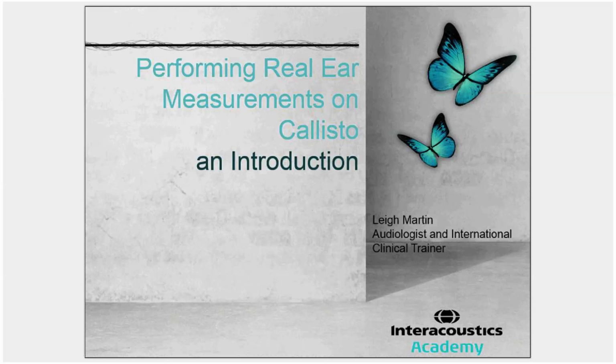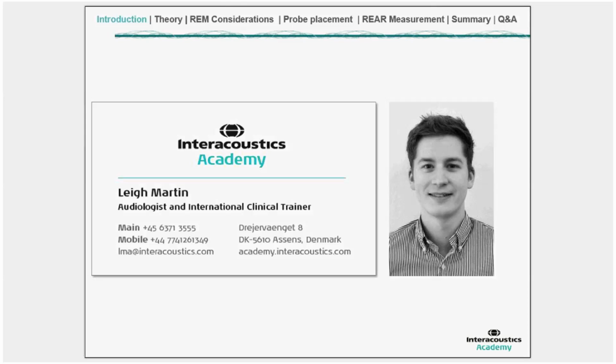Today the webinar is going to be focusing on performing REM measurements, in particular with the Callisto device. We will be looking at this from more of a clinical perspective rather than a technical one. But let's crack on with today's webinar, and we can go from there.